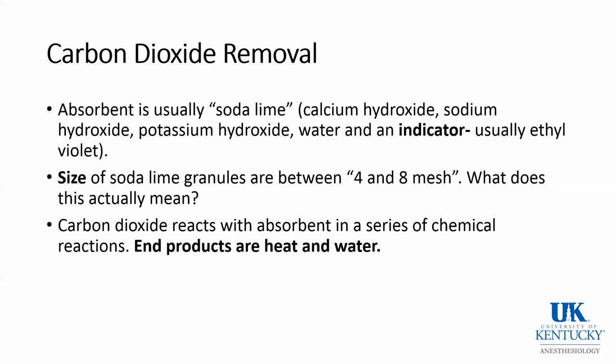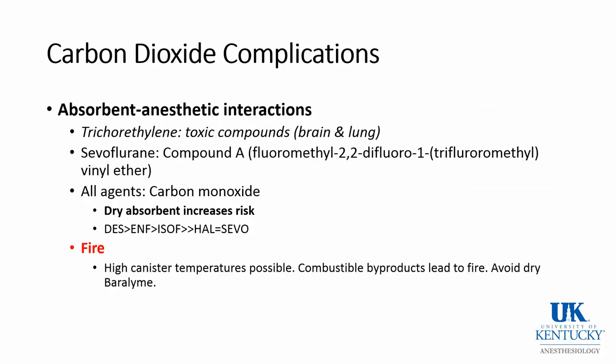Carbon dioxide reacts with the absorbent in a series of chemical reactions. The end products are heat and water. There are complications, such that there are absorbent and anesthetic interactions. Some of them are old, with trichloroethylene, where toxic compounds were created. Sevoflurane reacts to form compound A. All agents have the potential to produce carbon monoxide. Dry absorbent increases the risk of carbon monoxide production.